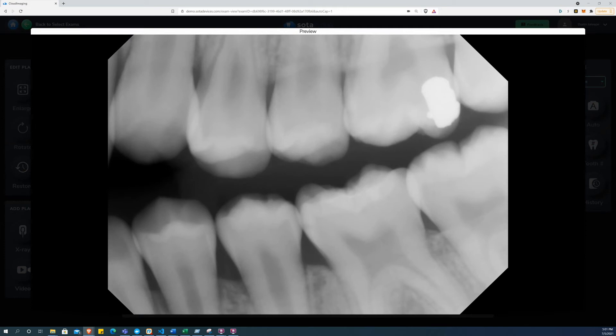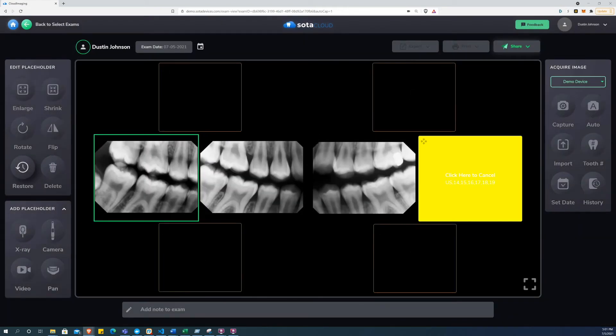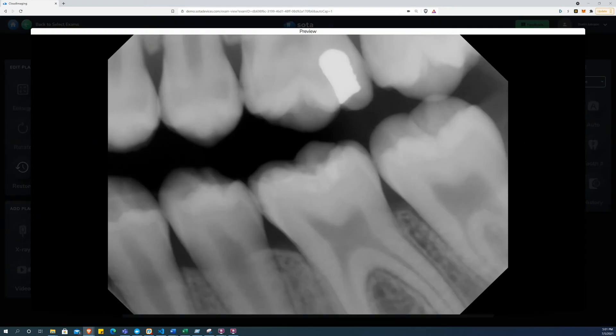As you take images, a preview will be displayed. The preview time is fully user customizable. For the purposes of this demo, I have set the preview time to a short 3 seconds.